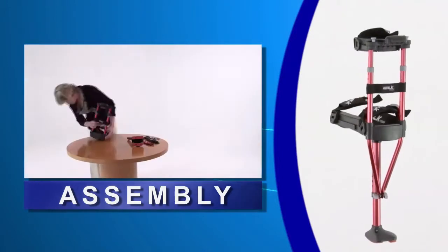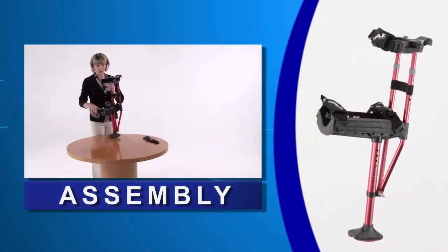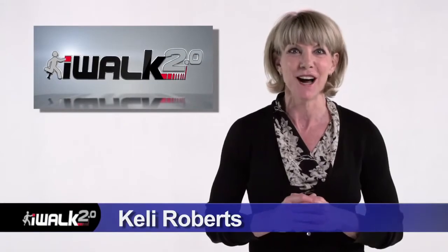Hi, I'm Kelly Roberts. Now I'm going to show you how fast and easy it is to assemble and fit your iWalk. There are no tools required and it only takes a couple of minutes. So follow along and I promise to have you iWalking in no time.